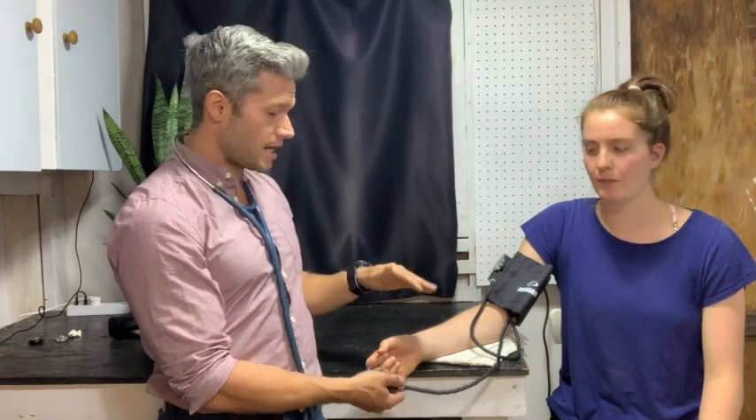When you're practicing with your volunteers, participants, or peers, if you're doing repeated measures, check in with whoever you're working with and make sure their arm isn't getting too sore. As you'll notice if you get a lot of practice, it can get pretty sore and achy having the blood occluded from your forearm over and over. So we got systolic and diastolic — the first sound or when you first start hearing blood come through the cuff, and then the last sound that you hear. Other than that, you should have notes in the virtual tutorial, the online lecture, as well as this video, and then follow through the procedures in your lab manual as closely as you can — that should help you get good results for your lab activity.